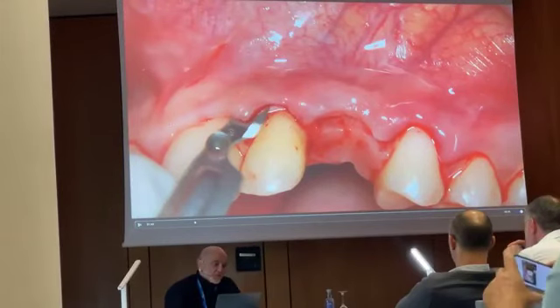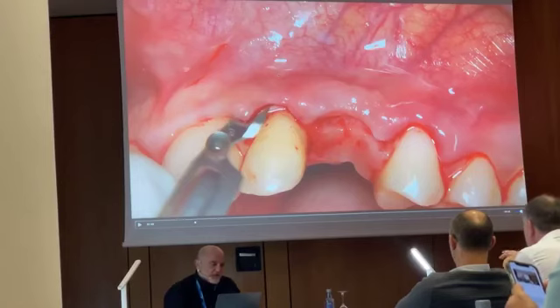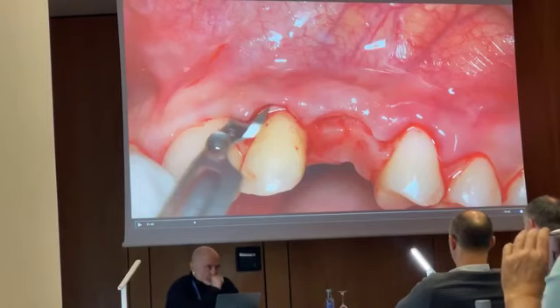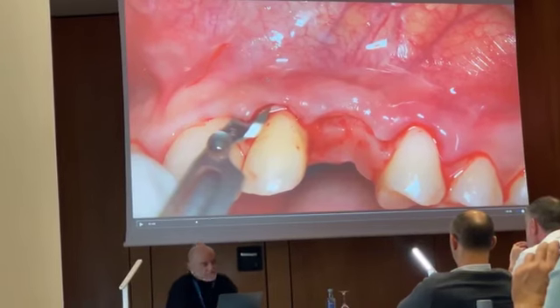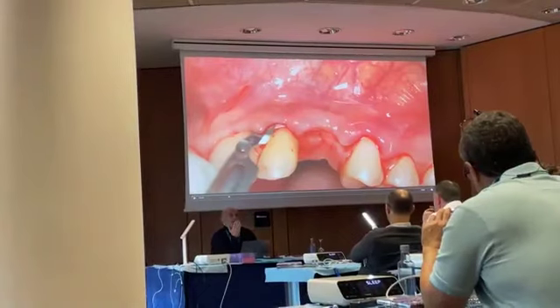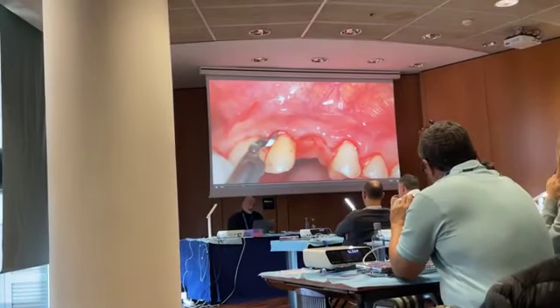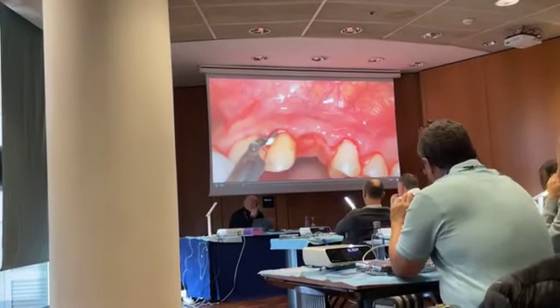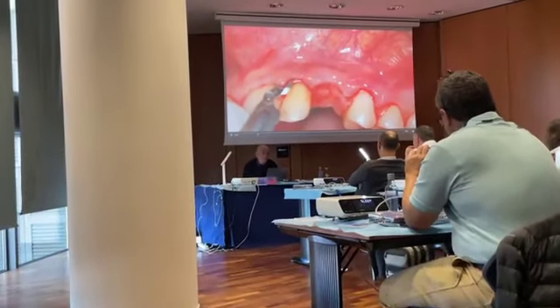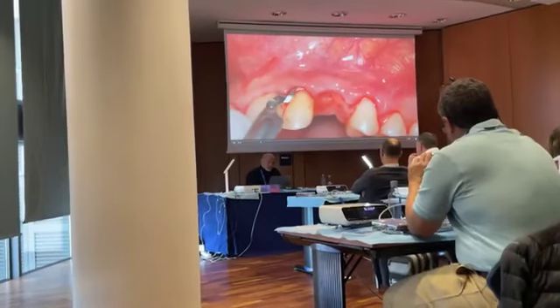You see, this alveolar mucosa here is inserted in this area that makes like a shadow here, you see here. This is the area where the muscles of the alveolar mucosa insert onto the periosteum. And the objective of this that is called deep split thickness incision is to see the alveolar mucosa detaching from the periosteum, so as soon as you can, you keep your blade parallel to the external surface and make the superficial incision that removes the whole muscles from the alveolar mucosa and allows the advancement of the flap.